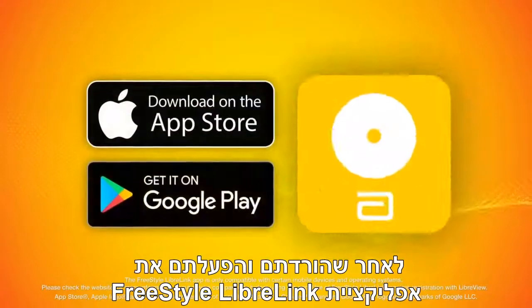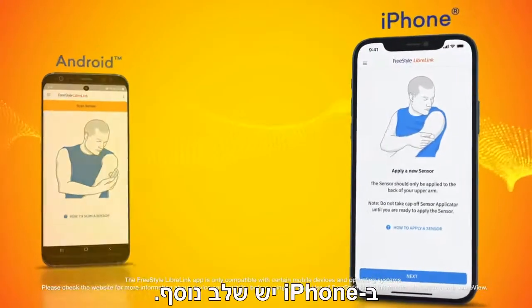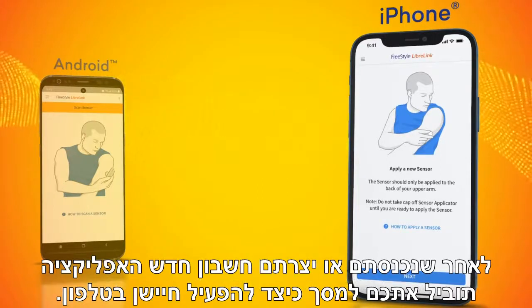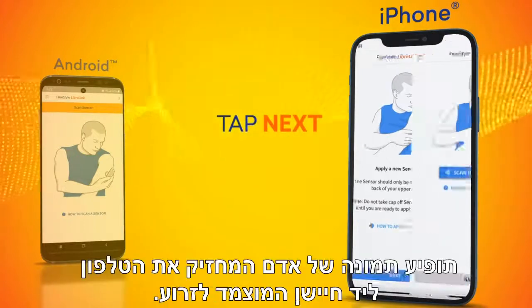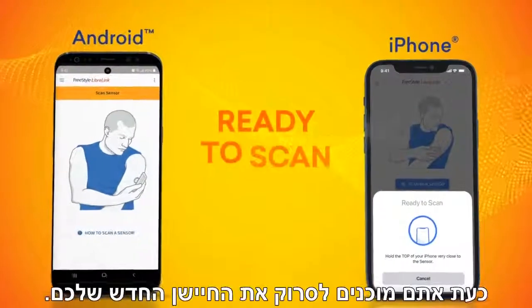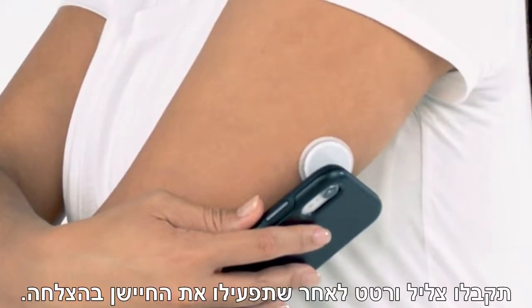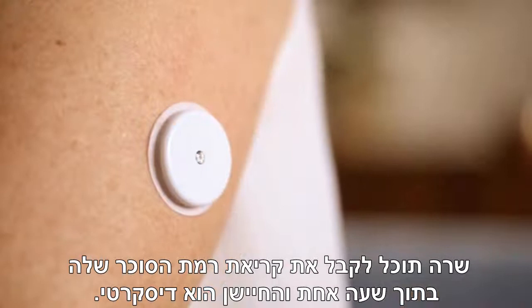Make sure the sensor is secure after application. All that's left is to start the sensor. After you've downloaded and started the FreeStyle LibreLink app, you will need to scan to start your new sensor. On the iPhone, there's an additional step. Once you've logged in or created a new account, the app will bring you to the 'How to apply a sensor' screen on your phone. Tap next. An image of a person holding the phone next to a sensor on the arm will appear. Tap 'Scan new sensor.' Hold your smartphone to the sensor to scan it. You will receive a tone and vibration after you have successfully started the sensor. Sarah can now get her glucose reading in one hour.